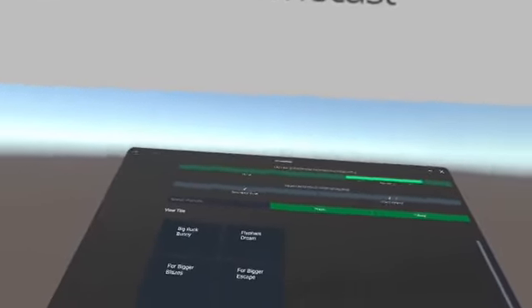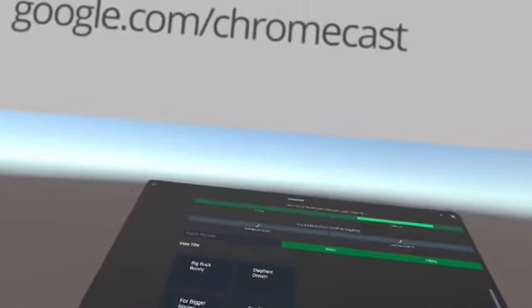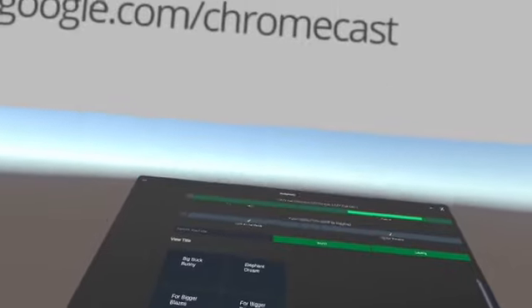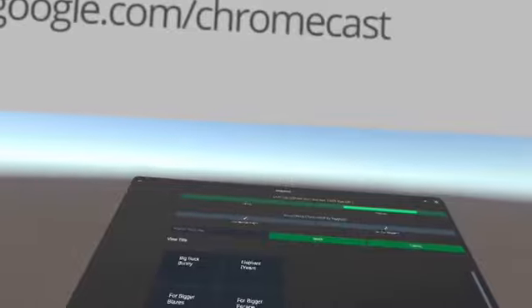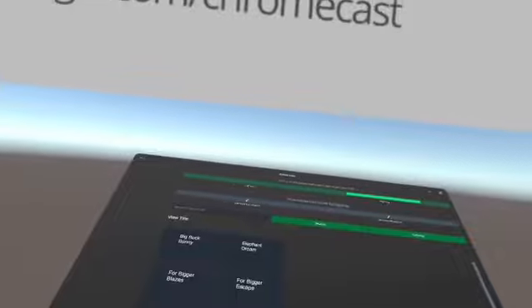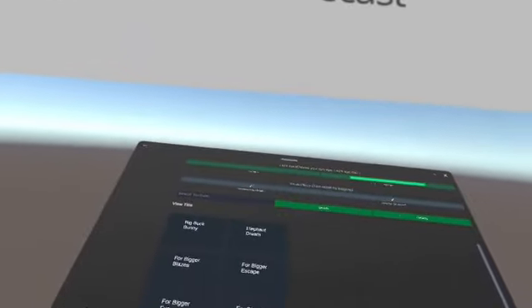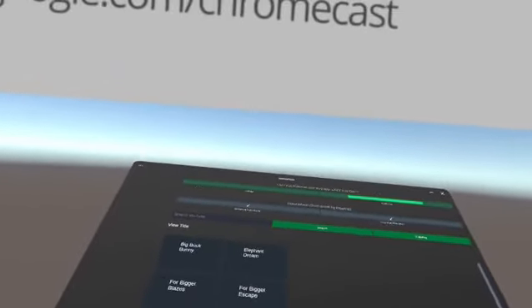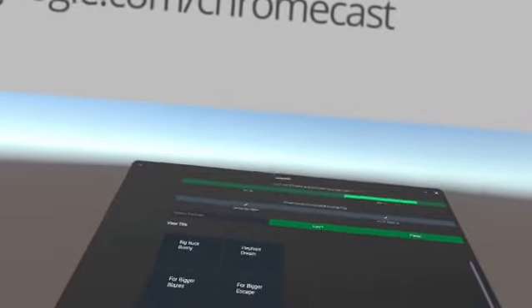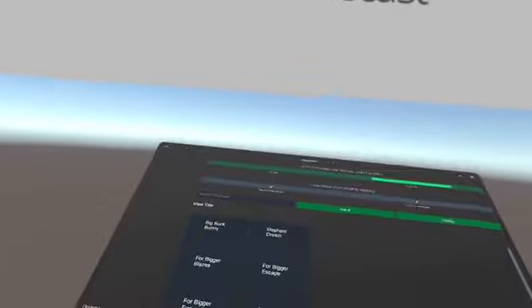The only problem with Amblotube is that because this works on Meta VR, and you are typically not in a natural environment but in a VR environment, there can be some strain on your eyes. That is why we say that you cannot use this for hours and hours. Just use it for 30 to 40 minutes, maximum 1 hour, then stop it, then view it again, because this is not a natural environment. Screen time is very bad for kids. It is not advisable to keep using this all the time. So this is also a limitation of Amblotube, so keep that in mind.